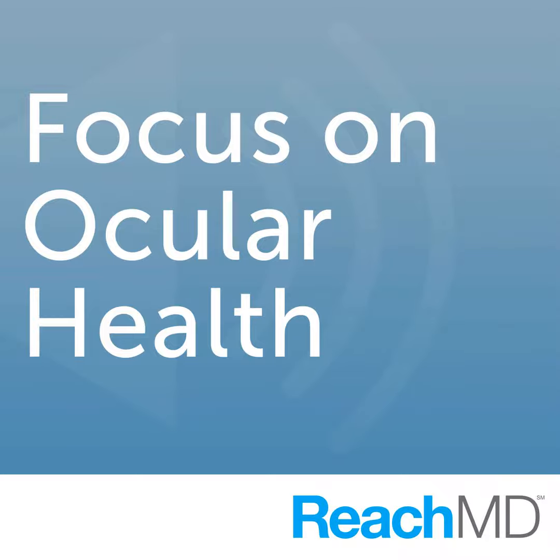Now, the type of blindnesses that this does work with that we've tested are inherited retinal conditions like retinitis pigmentosa. So this is an inherited condition which occurs in 1 in 4,000 and results in damaging the rods and cones of the light-sensing cells of the retina. And so what we're doing with the chip is basically bypassing those damaged light detectors and jump-starting the remaining nerve cells in the eye and sending the information to the brain. So that's how this works.